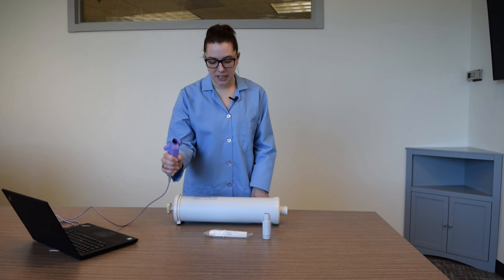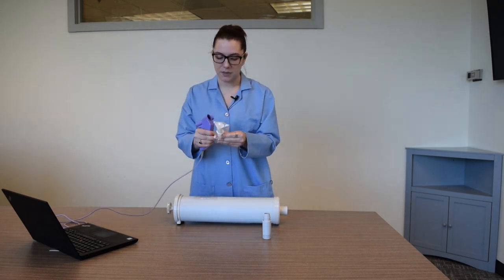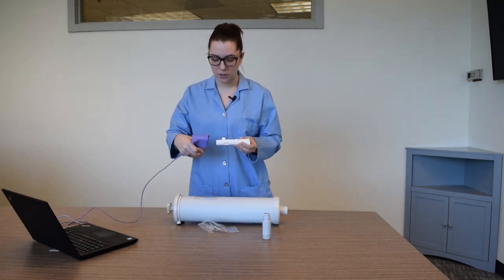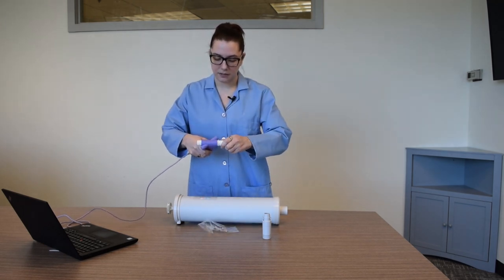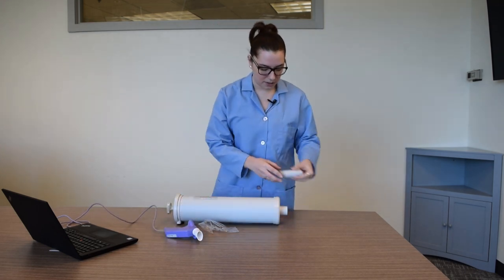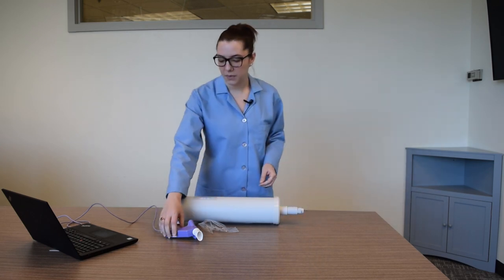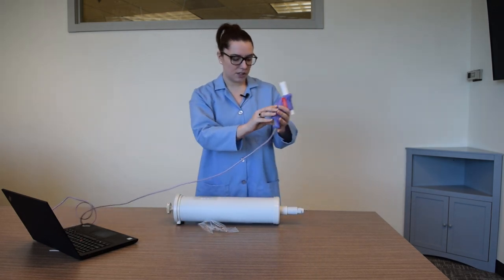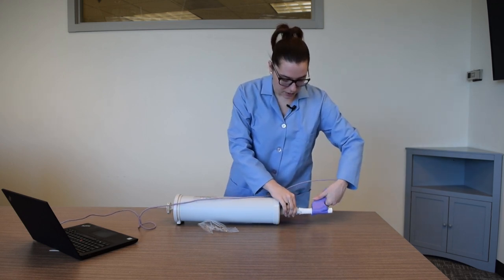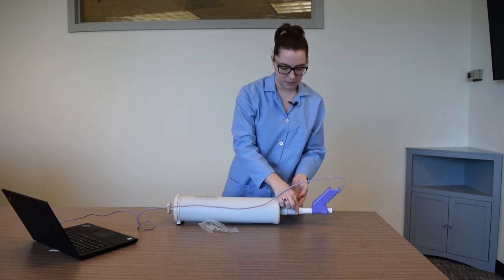Take your Easyon PC handheld sensor and your spirette and attach the two of them together. Make sure that the two arrows are aligned. Next, take the calibration adapter and attach it to the syringe. From there, take your sensor and spirette and attach it to the calibration syringe, making sure the spirette goes underneath the clips.